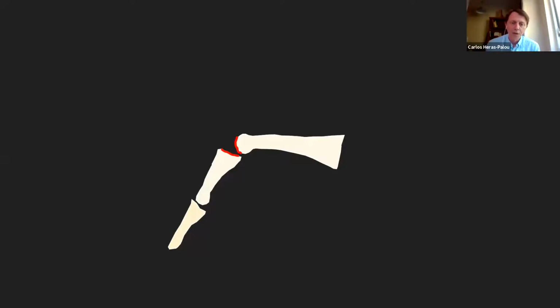Well, if you do a roundy bit into roundy bit, you can dial in as much flexion as you want, so you can still adjust it. And it has another advantage, and that is that if you do like a cylinder in a cylinder, you cannot malrotate it. Well, if you do a flat surface against a flat surface, sometimes you can get confused and malrotate it a bit. So I would advise you not to cut it flat, just get a rongeur and take the bone. You need some nice little rongeurs for this.